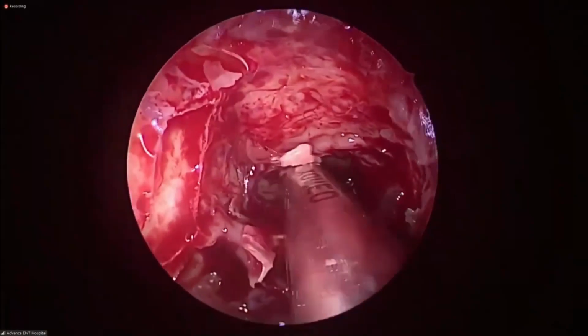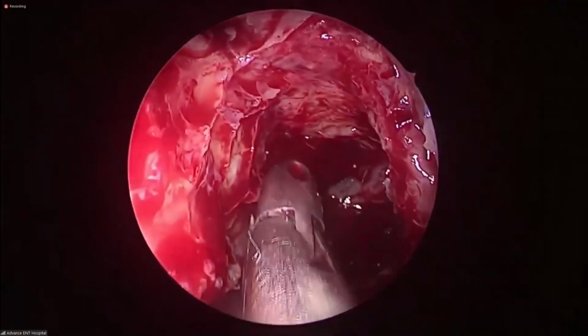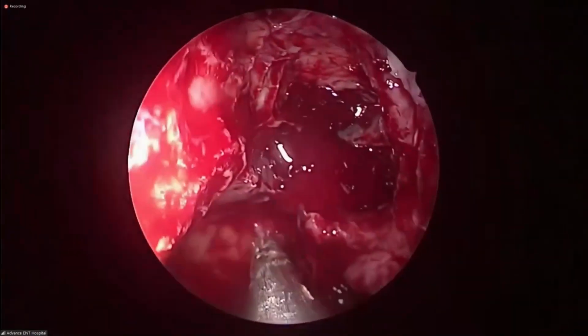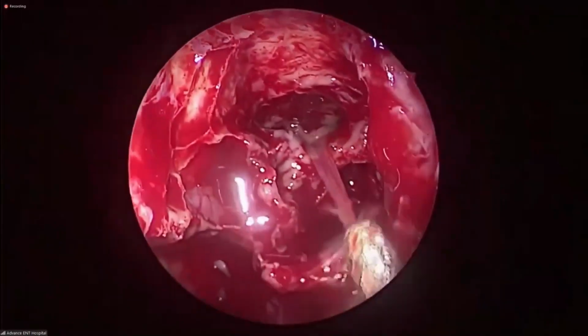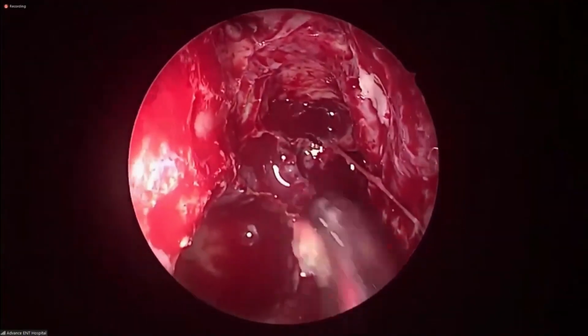We are flushing the skull base, posterior. Yes, model skull base. Yes, sir. Flushing it with the skull base. Fast. No, don't pour water. And see this, I have to join this.